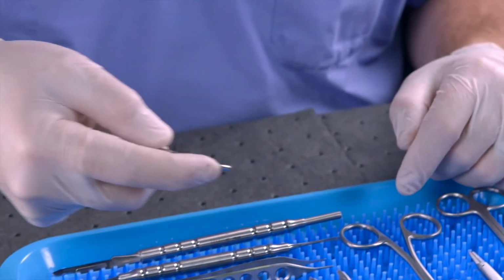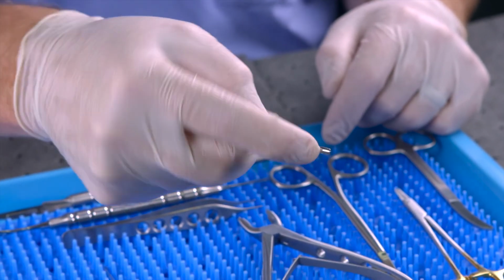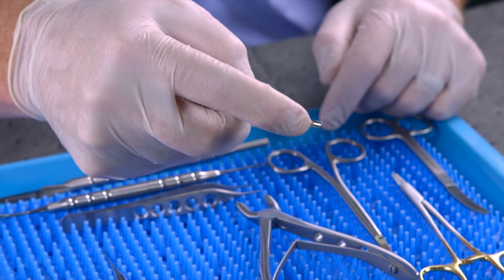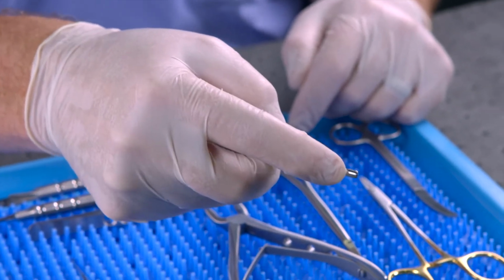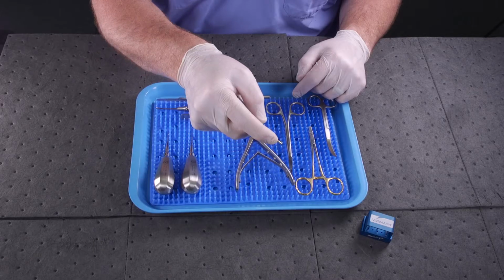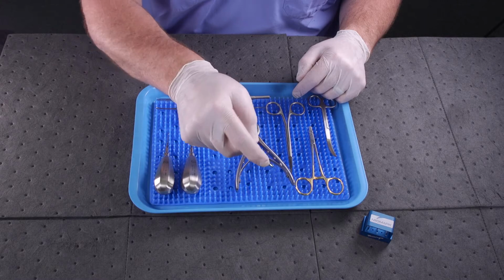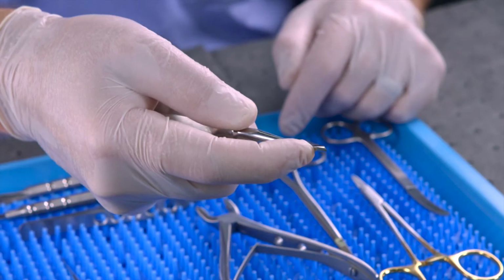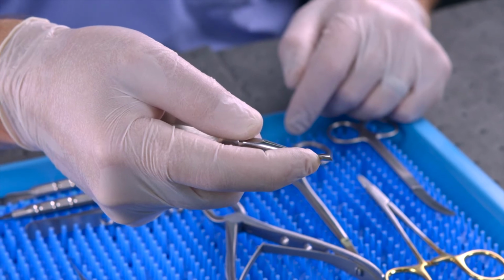That permits more power to penetrate, as well as an ease of oscillating in one axis to provide even deeper and deeper penetration into the periodontal ligament space. When the instrument is within the periodontal ligament space, then the instrument is twisted and held to fatigue and break down the periodontal ligament fibers.